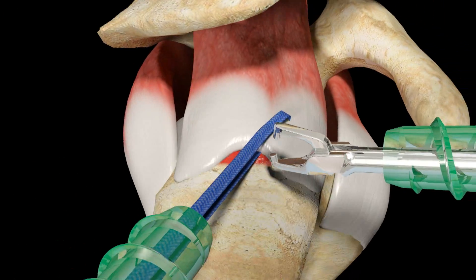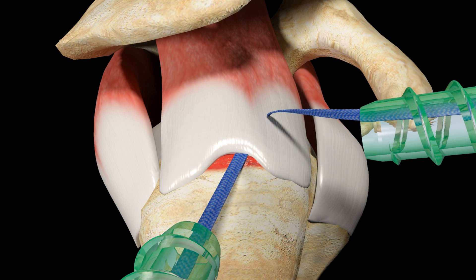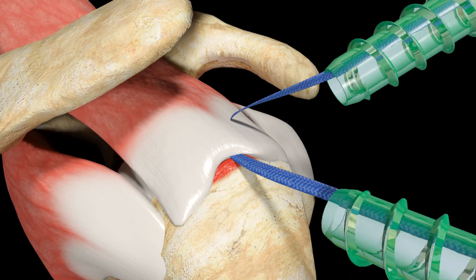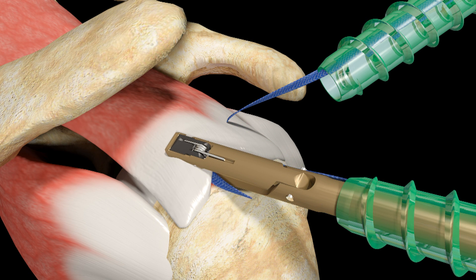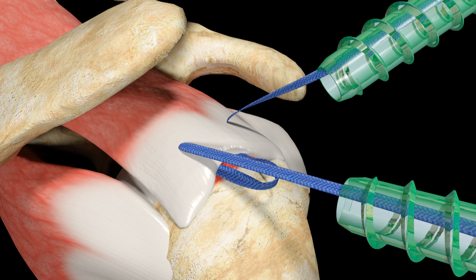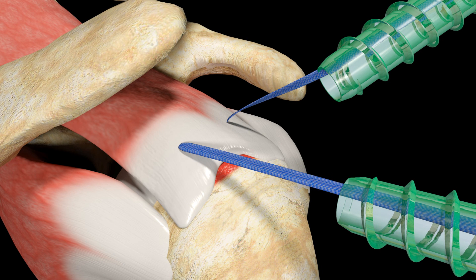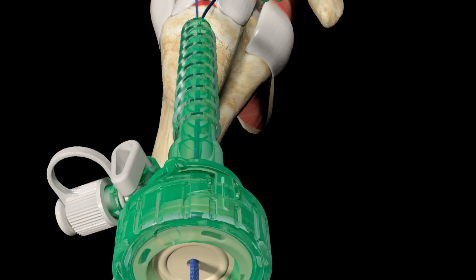Adjust the lengths of the Ultra Tape Suture limbs and using a Suture Loop Grasper, move the passed limb of suture to the anterior cannula and out of the way. Repeat the first passing step, now passing the second limb of Ultra Tape Suture through the more posterior portion of the tendon to be repaired. Using a Suture Loop Grasper through the lateral portal, retrieve the limb of Ultra Tape Suture exiting out of the anterior cannula and bring it back out through the lateral portal. An inverted mattress stitch has now been created.